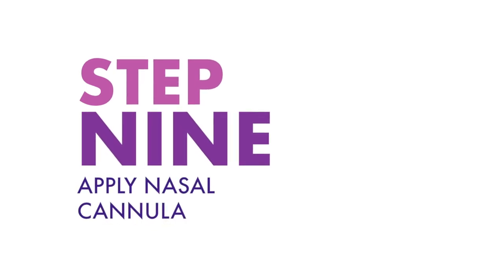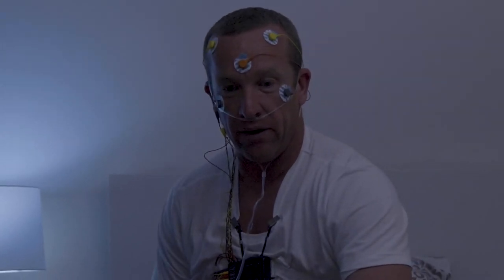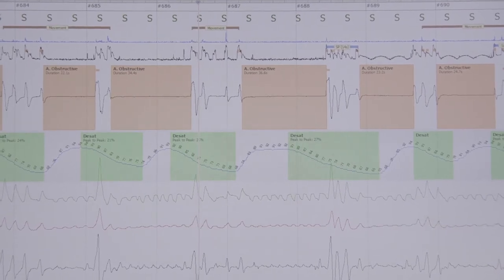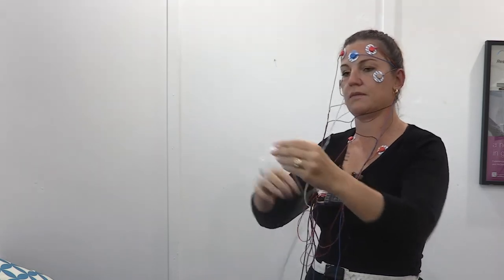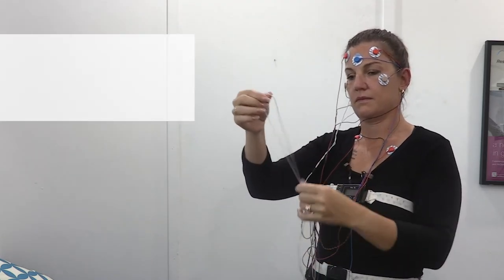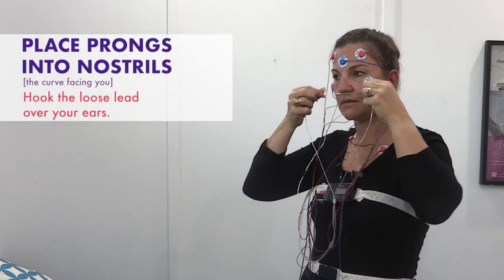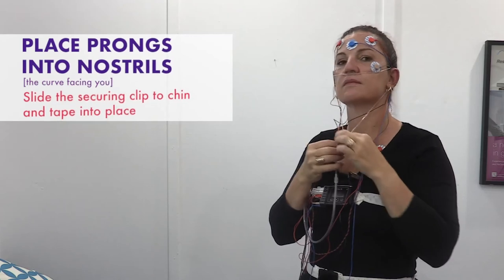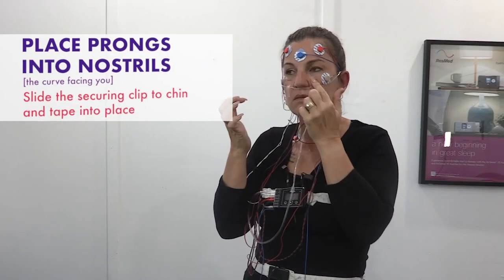Step nine: apply nasal cannula. The nasal cannula will record your breathing, snoring or any other abnormal respiratory data. If this falls out for an extended period, the study will need to be repeated, so it is vitally important that it is secure and not removed. There are two prongs with a curve in them. Place the prongs into your nostrils with the curve facing toward you and hook over your ears. Slide the securing clip up to your chin and then tape into place.